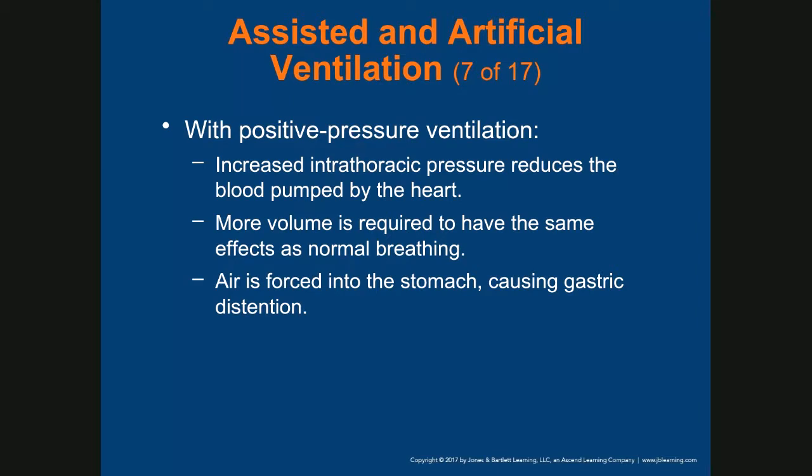And guess what? If you squeeze that bag and you don't see chest rise, the air went somewhere, right? And if you don't see chest rise, it doesn't mean you must increase pressure. That's a bad practice. We squeeze the bag, there's no chest rise, we force it in at the patient. No, right? If you don't see chest rise, the air went somewhere and it will take the path of least resistance. That's the stomach, right?